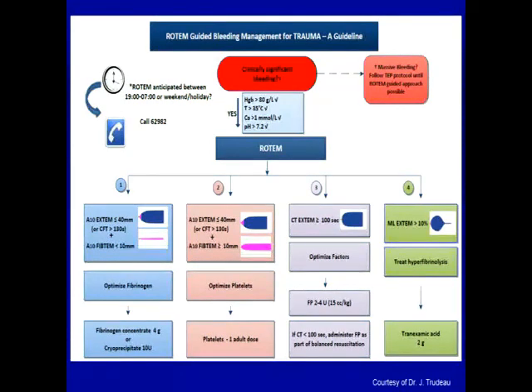And in scenario 4, you can see that when the lysis index exceeds roughly 10 to 15%, that indicates hyperfibrinolysis. Most of the literature uses 15% as a cutoff, and that would suggest that you should give more TXA. That's the value in being able to quantify fibrinolysis, because a lot of the algorithms, like in CRASH-2, use fixed dosing, and there's no way to really assess, outside of whether the patient stopped bleeding, the effect or need for redosing. So this gives you a tool that you can potentially use with results that come back quickly.